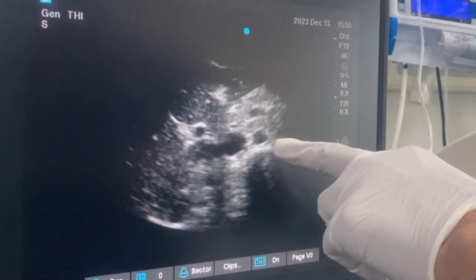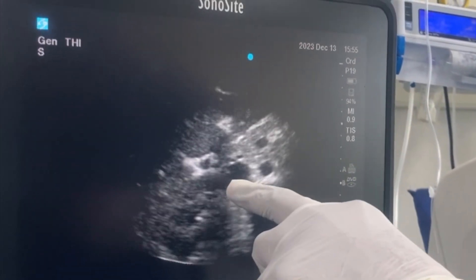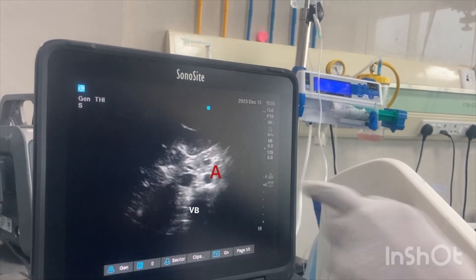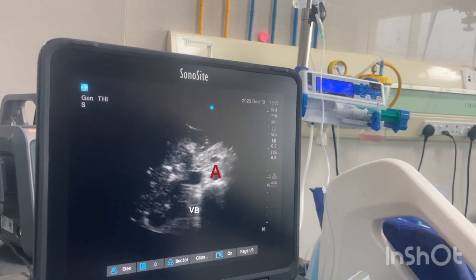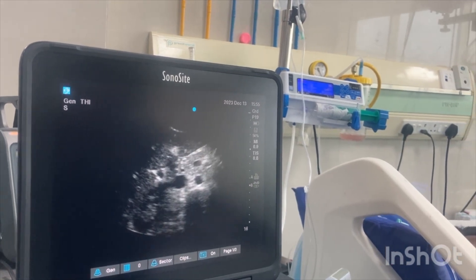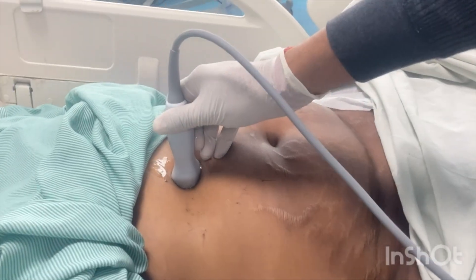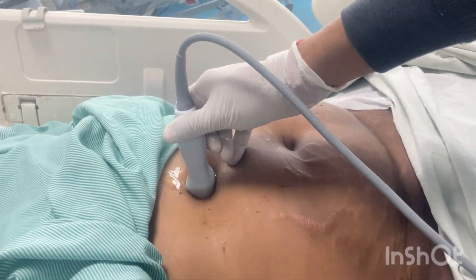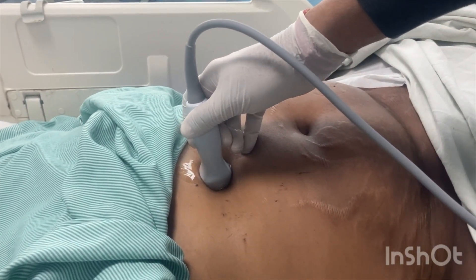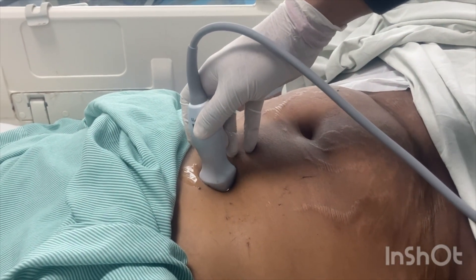This is the aorta, this is the IVC, and this is the vertebral body. Now I am going to rotate the probe, keeping the orientation marker cranially.